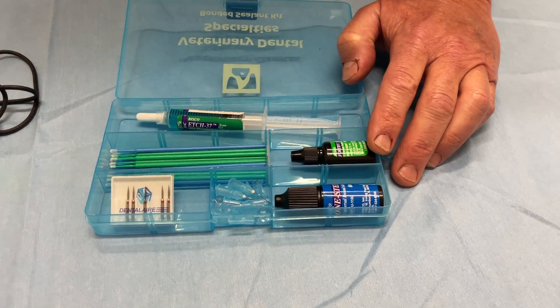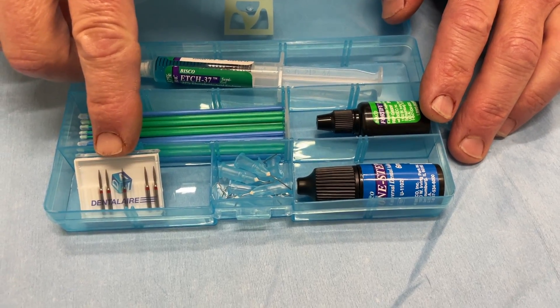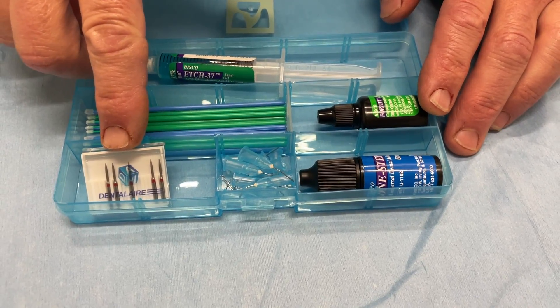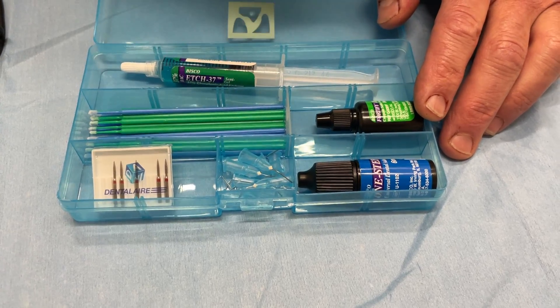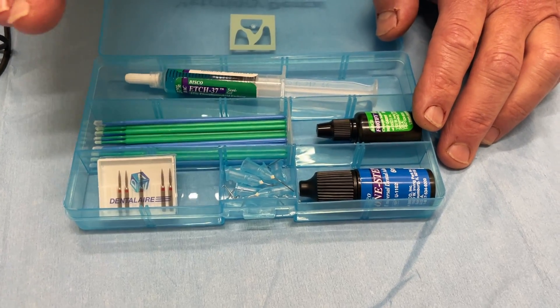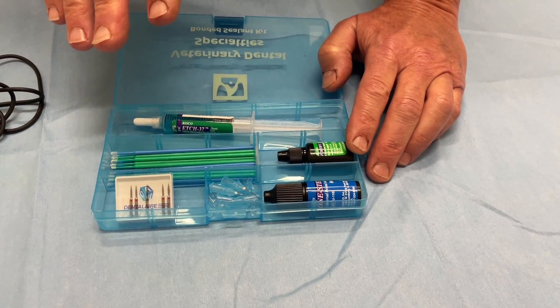So first of all, when I smooth out the teeth, I use what's called a fine diamond burr. I don't use sanding discs. I don't use white stones. I like this because it's one thing. It gets the tooth plenty smooth. It's done on a high speed, so I have water coolant on there. It takes about literally two seconds to do.